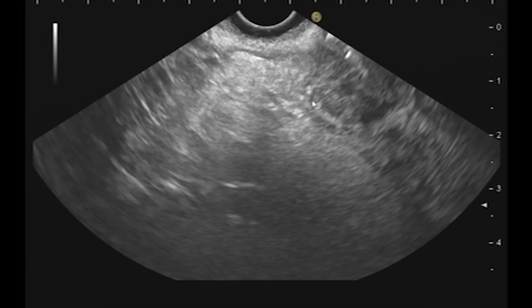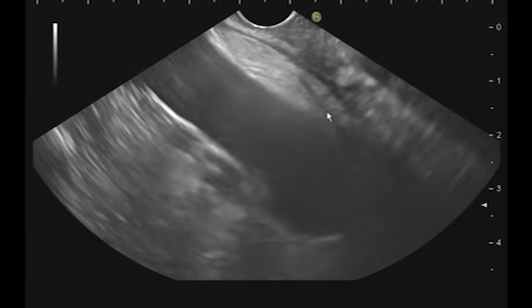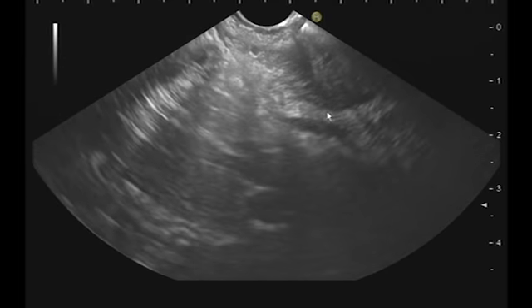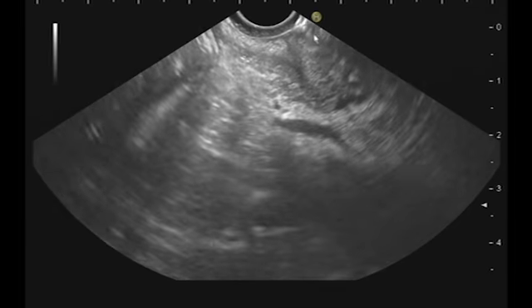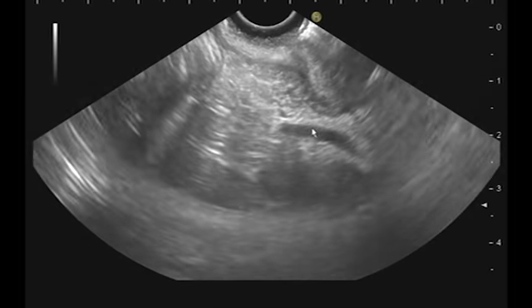Here you see that you have involvement of the pancreatic tissue. This is the pancreatic tissue, and here you see that the muscularis of the duodenum disappears. Now this is almost a T3 lesion of the papilla. Here again, you see the lesion. This is the pancreatic duct.